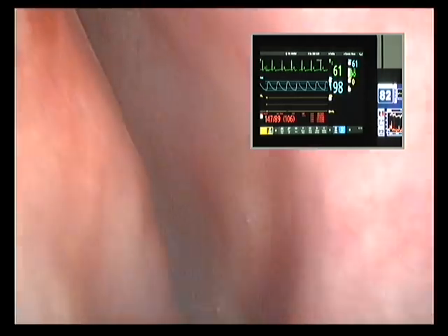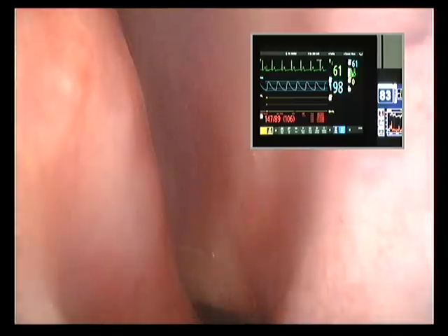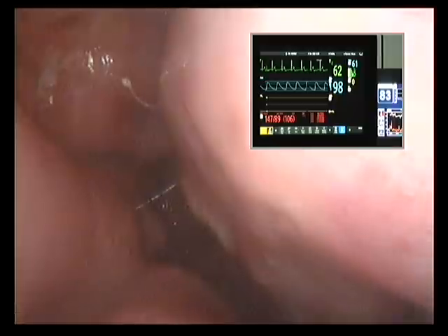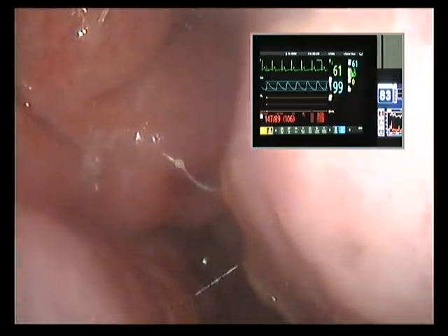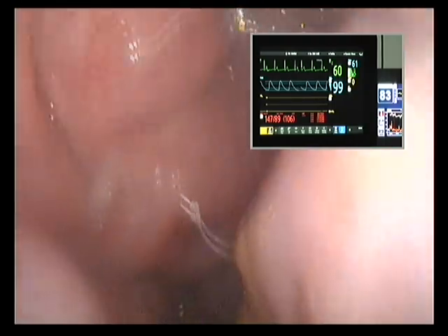He has a gross deviated septum on the right side, and he is undergoing his Drug-Induced Sleep Endoscopy with BIS monitoring. On the right side of the nose there is a grossly deviated nasal septum, so there is hardly any space to go inside. On the left hand side there is compensatory hypertrophy — a large inferior turbinate on the left side.